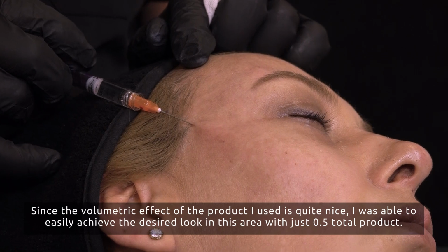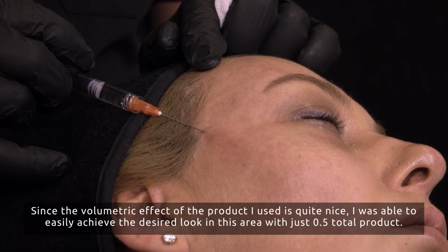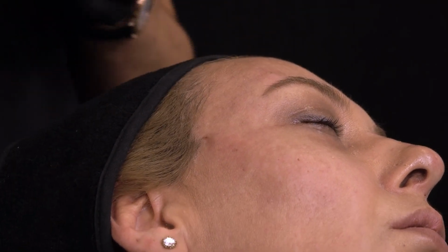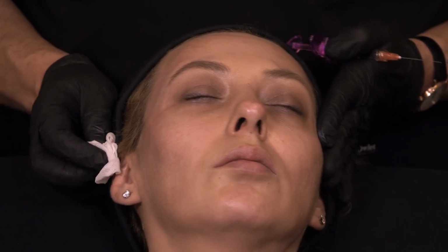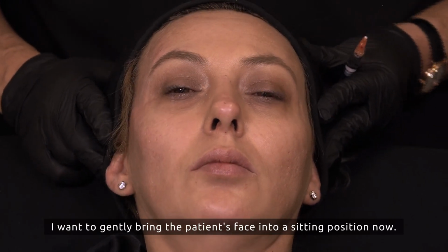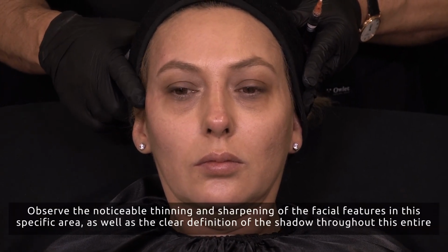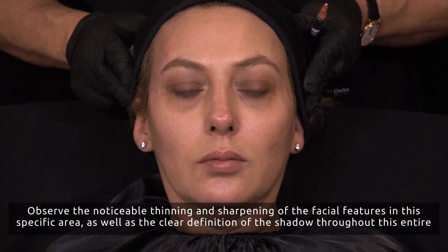Since the volumetric effect of the product I used is quite nice, I was able to easily achieve the desired look in this area with just 0.5 total product. The presence of 30 milligrams of hyaluronic acid is beneficial for me. I want to gently bring the patient's face into a sitting position now. Observe the noticeable thinning and sharpening of the facial features in this specific area, as well as the clear definition of the shadow throughout this entire region.